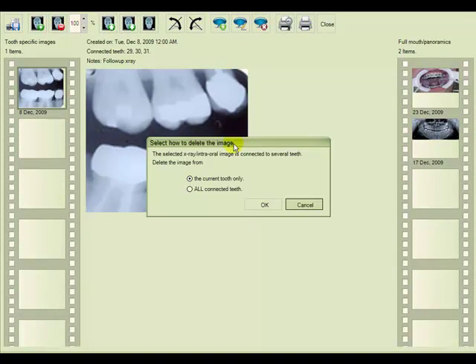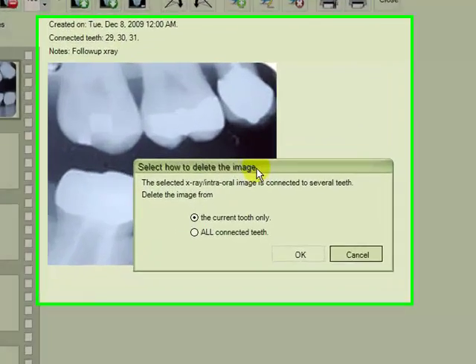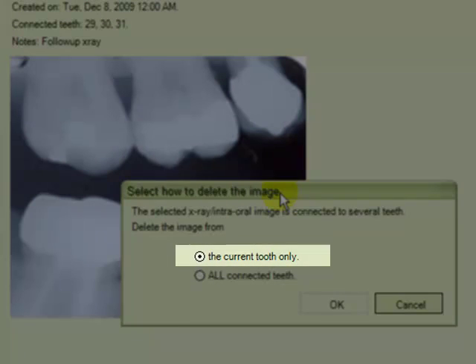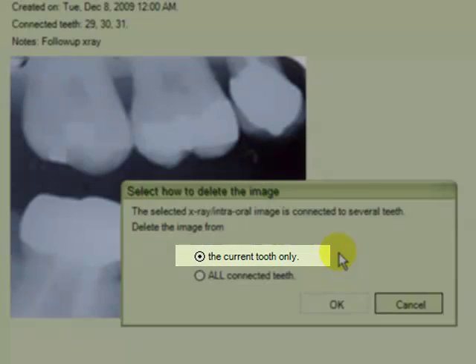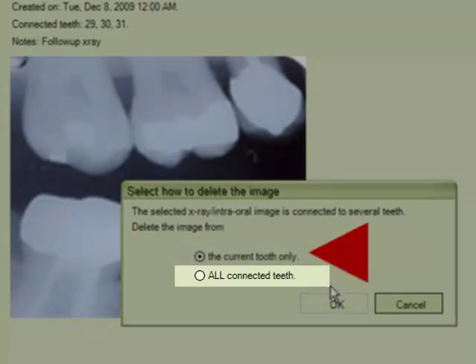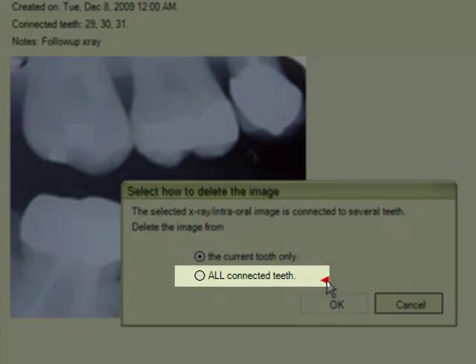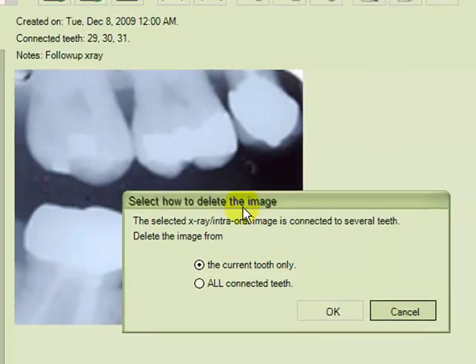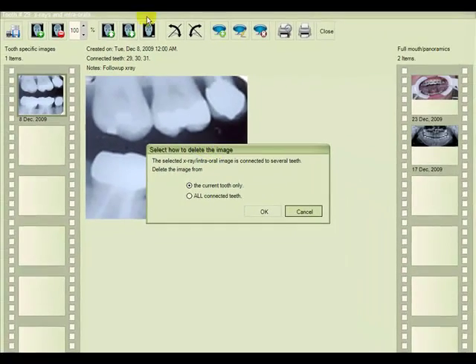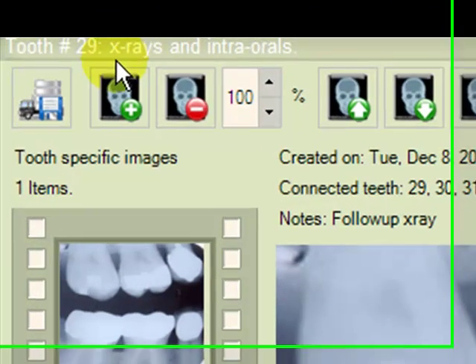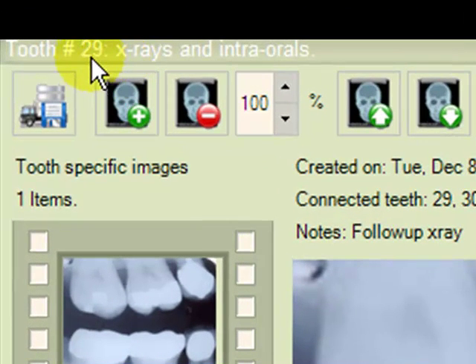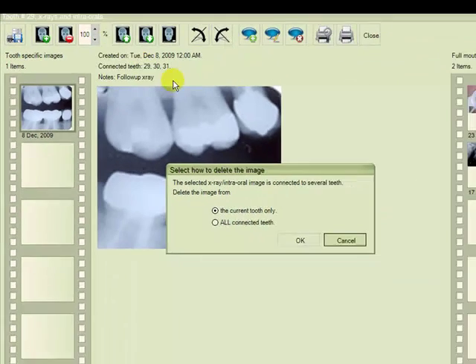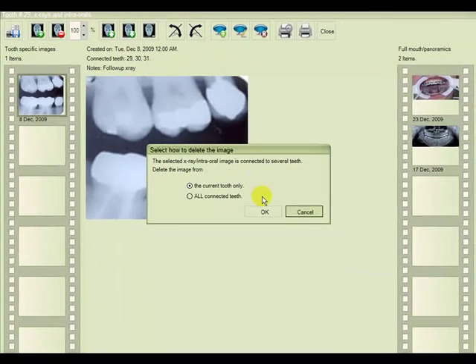In this mode, when we choose to delete an image, we are given the choice of the current tooth only or all connected teeth. If we look at the top of our window up here, we see that we are on tooth number 29 and that is the tooth that we wanted to unlink our X-ray from.